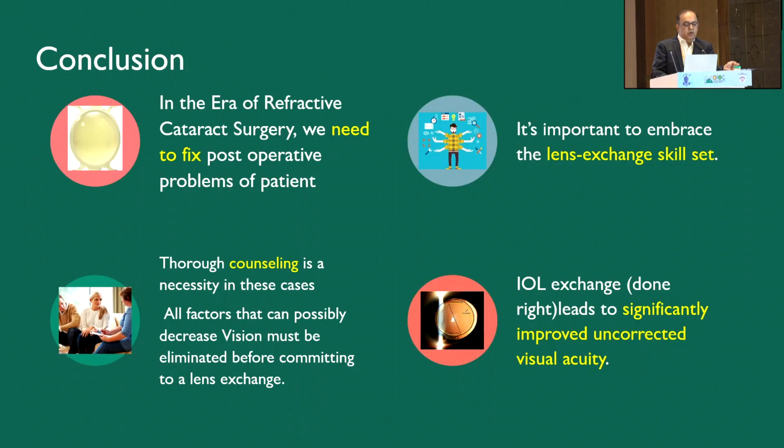So coming to the conclusion, in the era of refractive cataract surgery, we need to fix the postoperative problems of patients. Thorough counseling is a necessity in these cases. It's important to embrace the lens exchange skill set. IOL exchange leads to significantly improved uncorrected visual acuity.